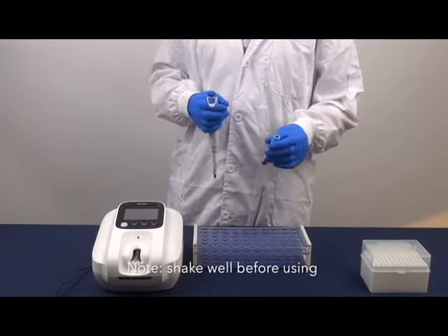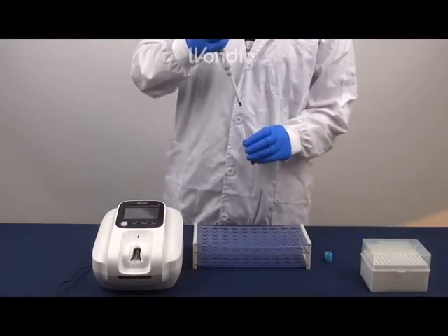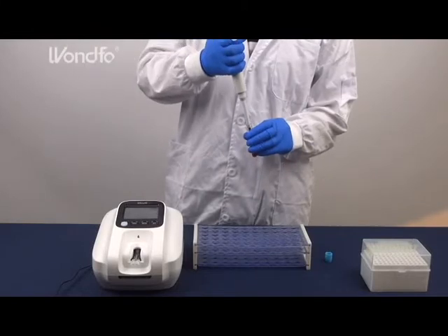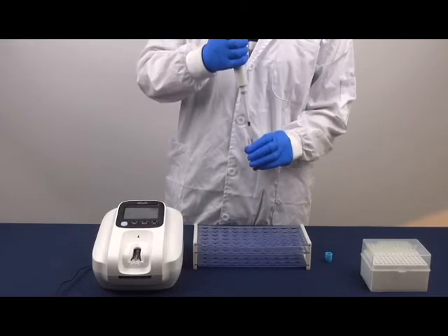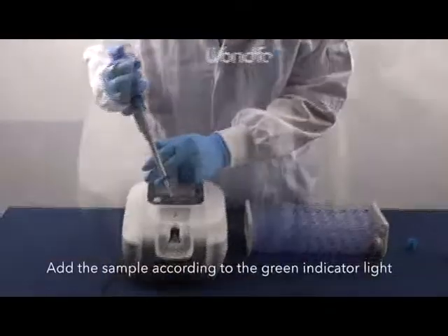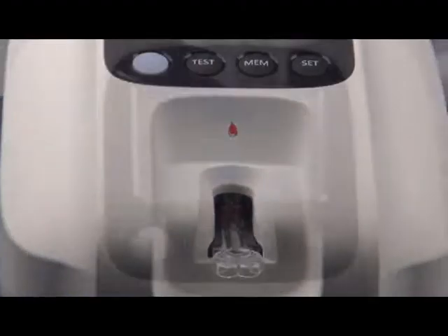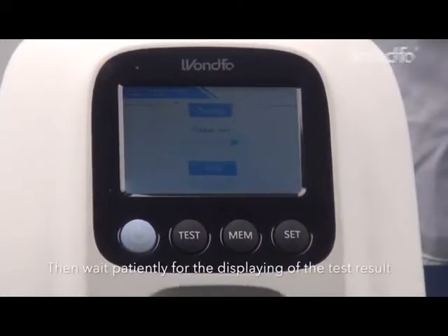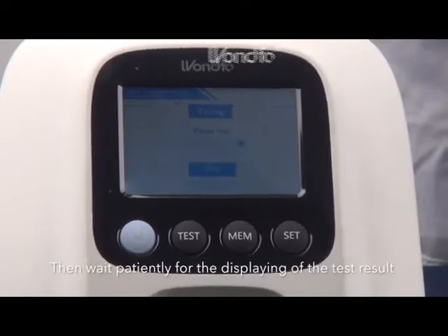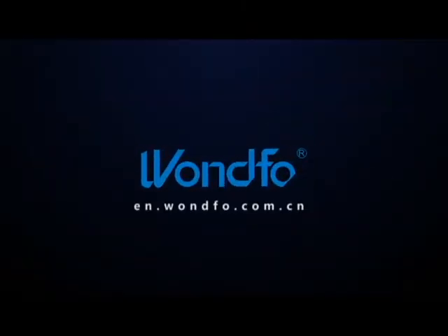Shake well before using. Add the sample according to the green indicator light. Now we can wait patiently for the displaying of the test result. At last, take out the used test card.